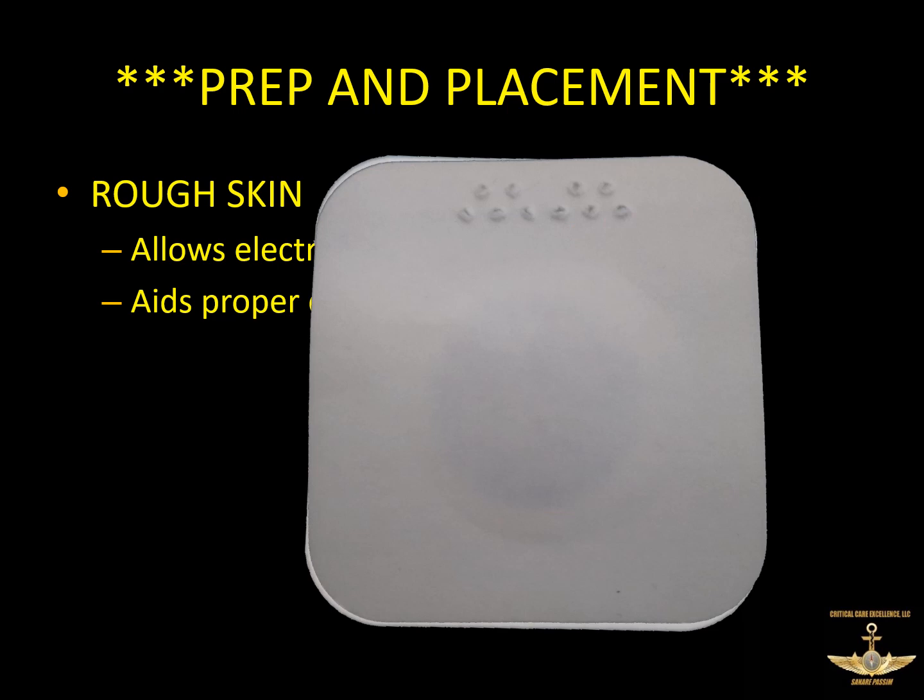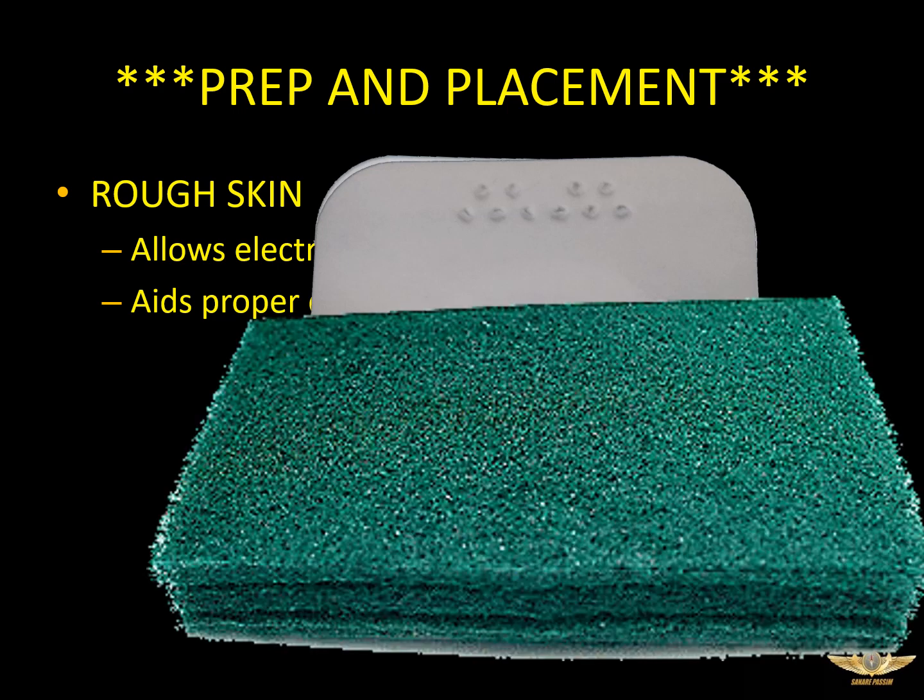Some of the older electrodes actually had little pieces of sandpaper there. Some of the newer alligator clip electrodes, like the hospital machines use, have strips of sandpaper between the electrode rows in the pack. They're all for the same thing, to abrade that skin and get rid of some of that dead skin. Some places, mostly seen in EMS agencies, will carry those little green scrubby pads you can get from the store for like $1, and they'll cut up little strips of these, keep them in their EKG kits, and use them for their abrasive quality.